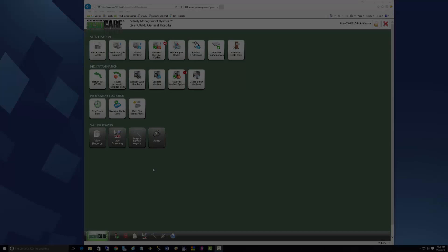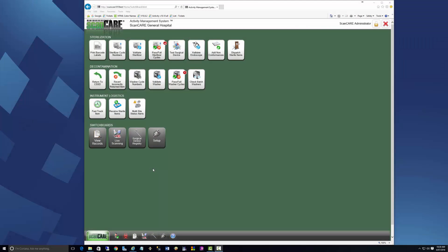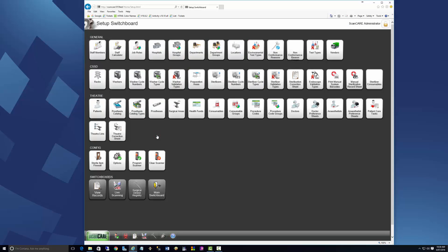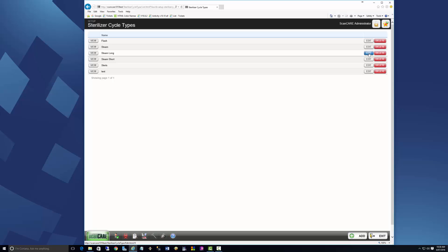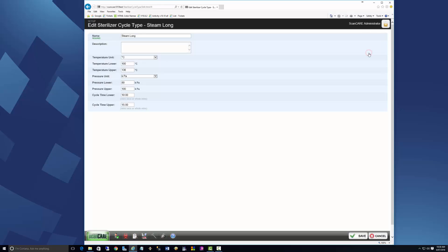In version 10.10, the units of measurement used for sterilizer and washer cycle type parameters are configurable. Let's take a look at the sterilizer cycle type screen. To demonstrate, let's take a look at the cycle type called steam long.